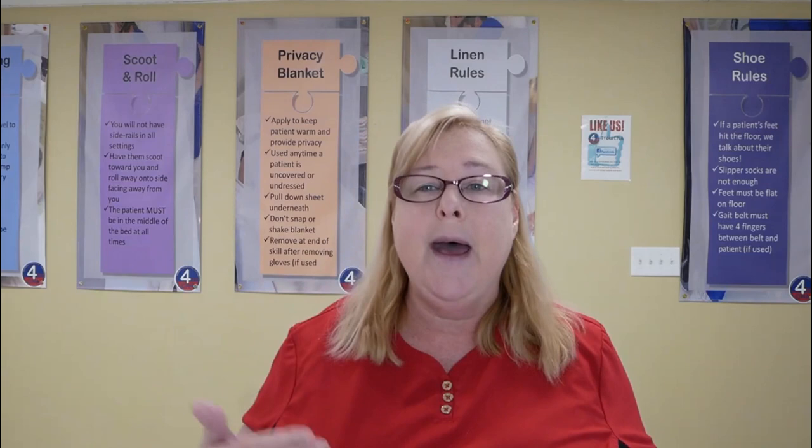Okay, so this is actually a tested skill, catheter care, just plain catheter care. This is a mannequin skill. So we're going to have a catheter that's in a mannequin, and we are going to have to keep it clean. So catheter care, remember I said that with catheters, the biggest risk is catheter-acquired urinary tract infections, or CAUTIs. That's the biggest risk with catheters.